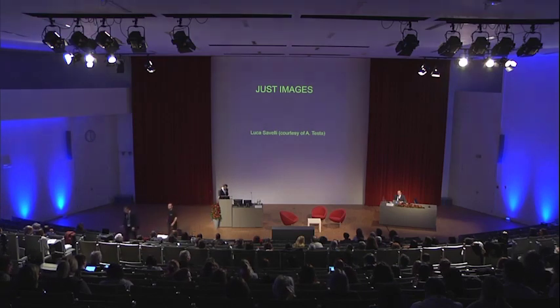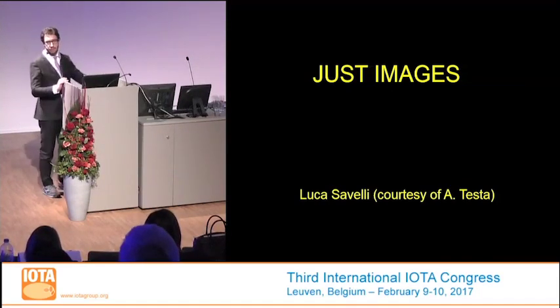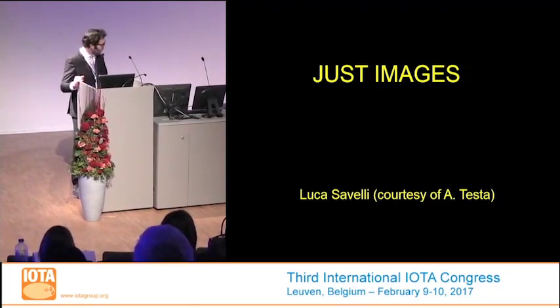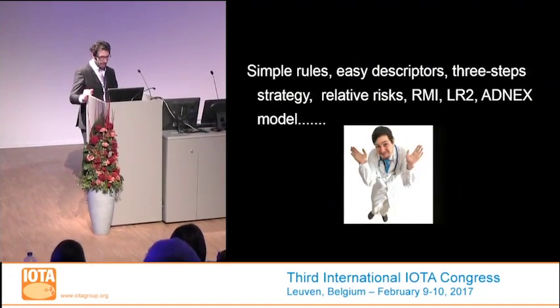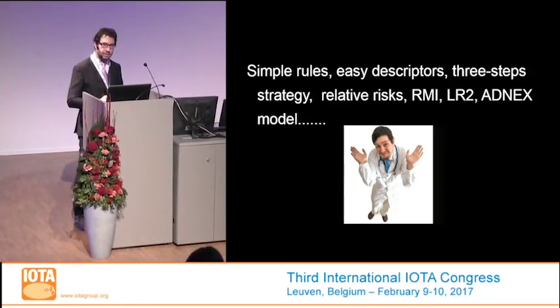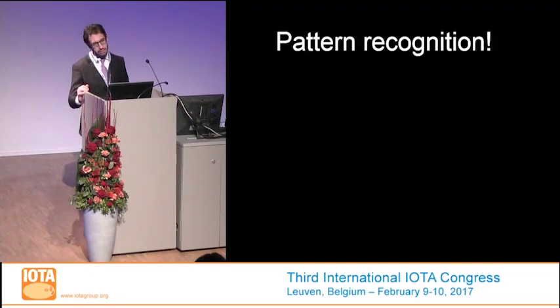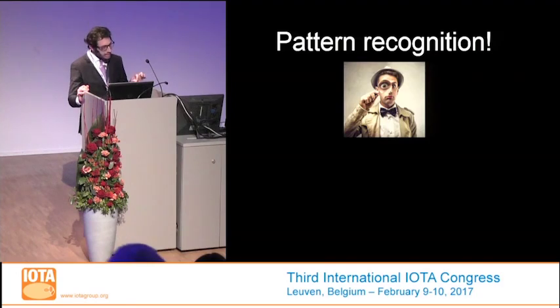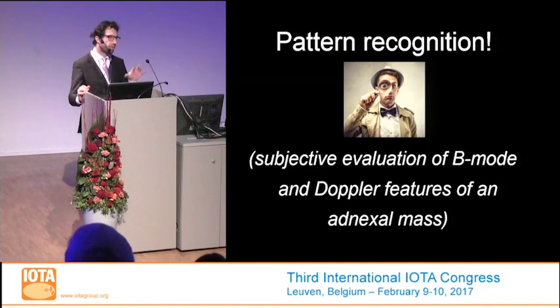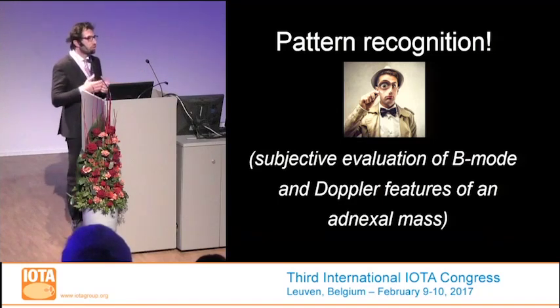Okay, just images. I must admit, I don't know exactly what Dirk meant when he invited me to give this talk, so I had to imagine, and I hope I'm on topic. We have heard much in these days about simple rules, easy descriptors, relative risks, RMI, logistic regression tool, ADNEX model, and so on. But in everyday clinical practice, the way in which we make the diagnosis is by using pattern recognition. That means evaluating the specific B-mode and Doppler features of a given adnexal mass and comparing what we see with the library of images that we have collected during the years of experience.